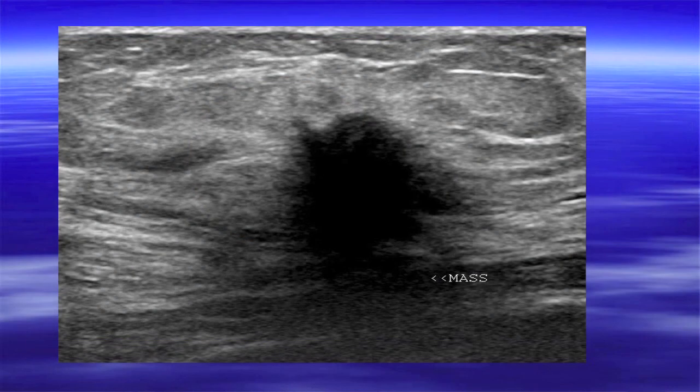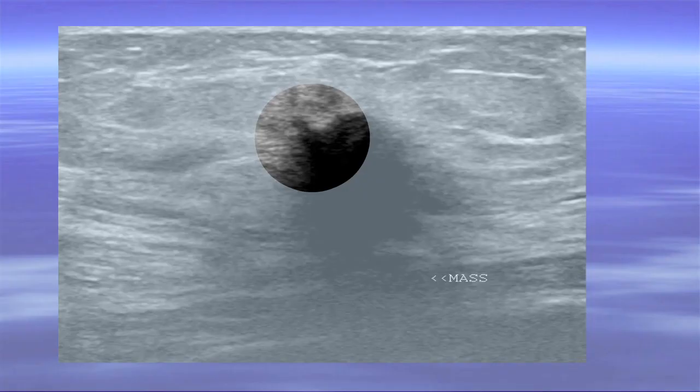Next. I think I have a couple more cancers. That's another breast cancer. See the irregular margins? Remember the tomosynthesis image, and I said, oh, there's that little spicule growing. This is a spicule right here. There it is, growing in. These little ones here, but this is the most conspicuous one. That's why I put that image. Next.